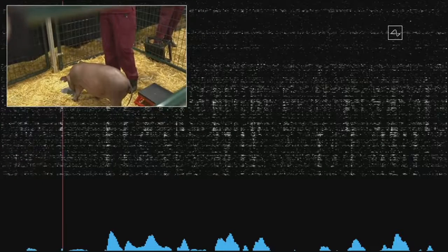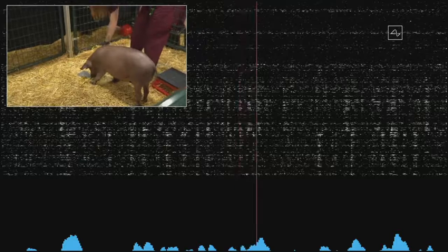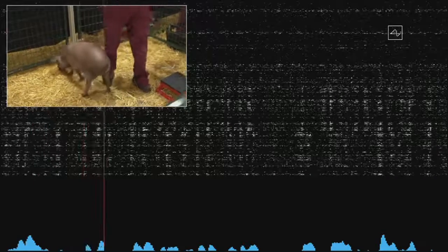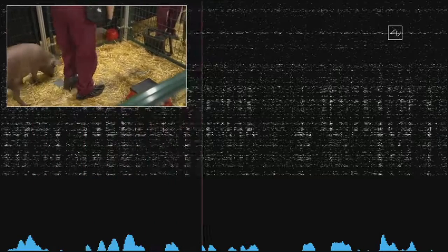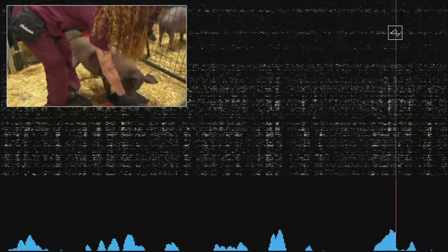So the beeps you're hearing are real-time signals from the Neuralink in Gertrude's head. This Neuralink connects to neurons that are in her snout. So whenever she snuffles around and touches something with her snout, that sends out neural spikes, which are detected here.